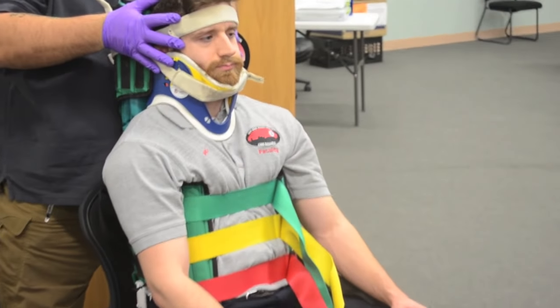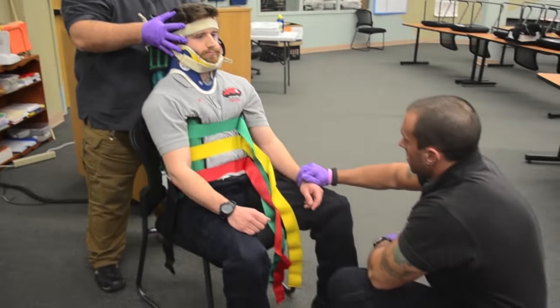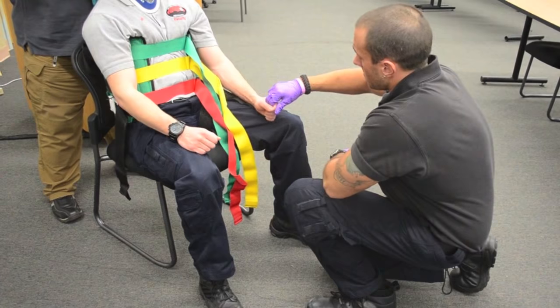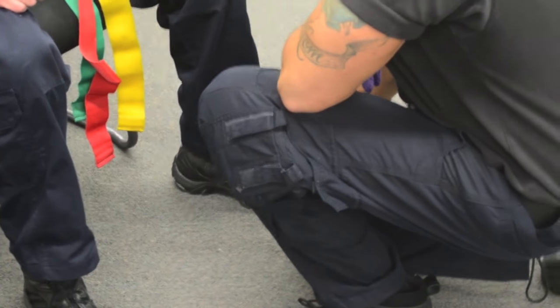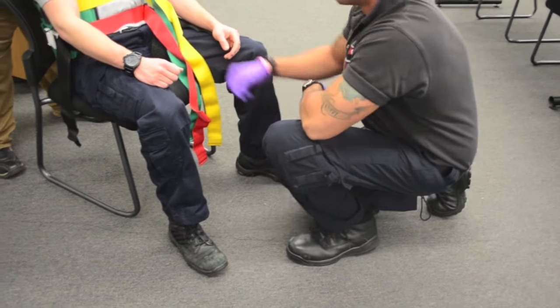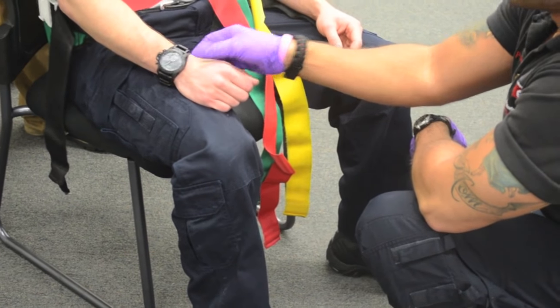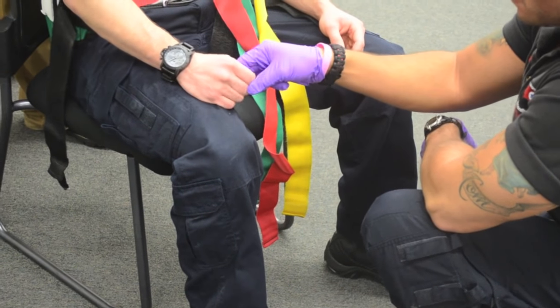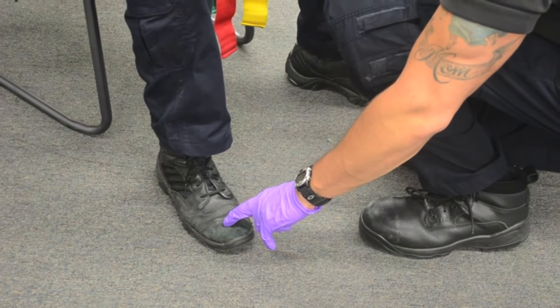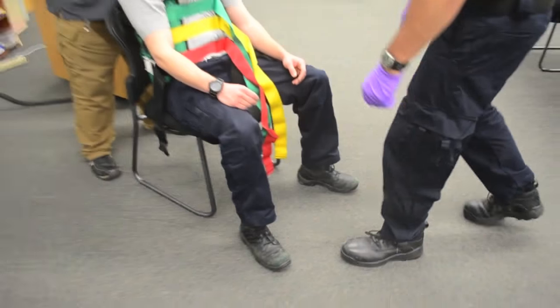The patient is secured to the head device. Re-check PMS. Distal pulse — present. Do you feel this? Yes. Distal pulse — present. Distal pulse — present. Do you feel this? Yes. Squeeze your fingers. Distal pulse — present. Do you feel this? Yes. Lift up. PMS is intact from all four extremities.